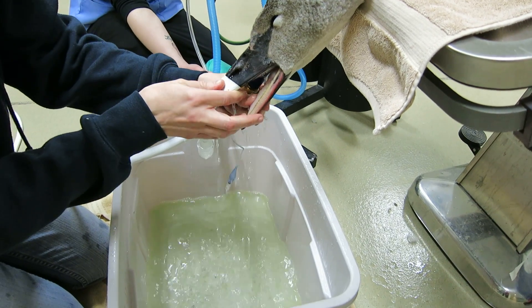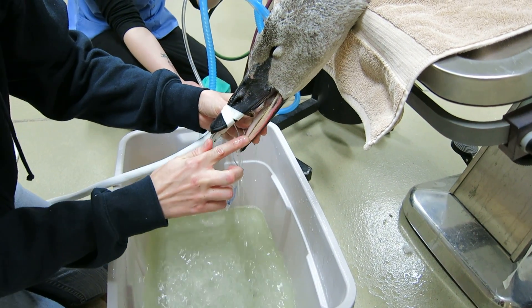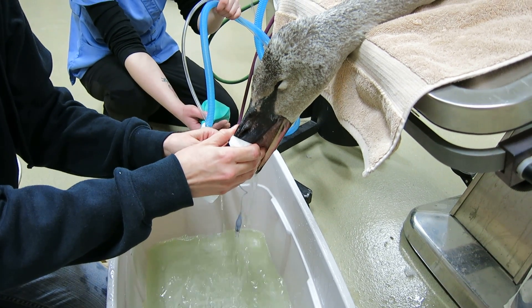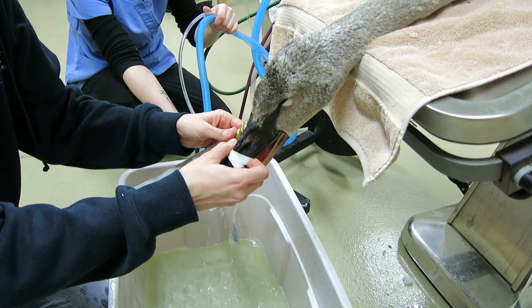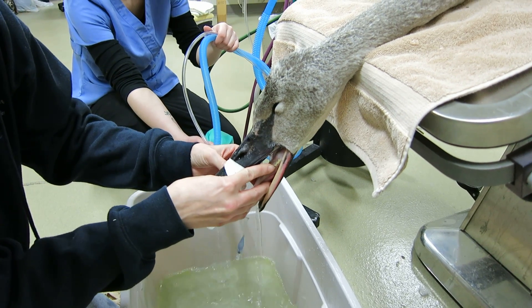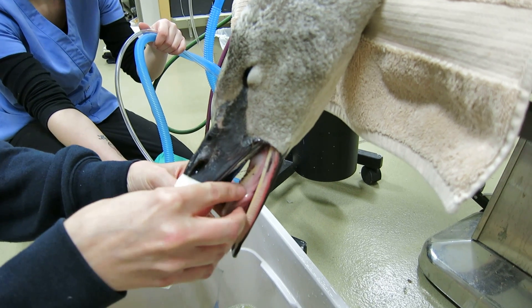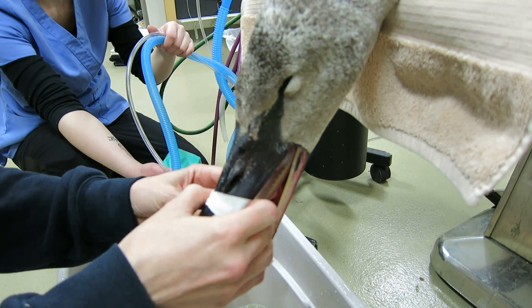We also have to watch because pieces can get caught up underneath their tongue or in the lamellae along the edges of their beak — those are used to filter out food and plant material from the water. The lead pieces may get hung up there, so we have to make sure we're not missing a piece. Even the tiniest piece of lead — there's a little speck right there, it might just be a pebble — but we want to make sure we get that out. The tiniest piece of lead can cause toxicity, so we've got to make sure we get all of it.